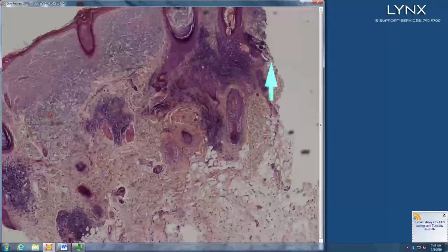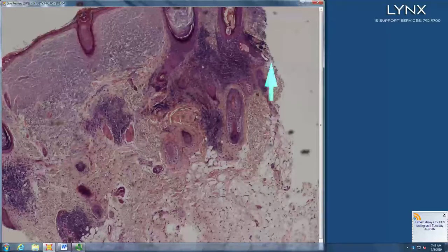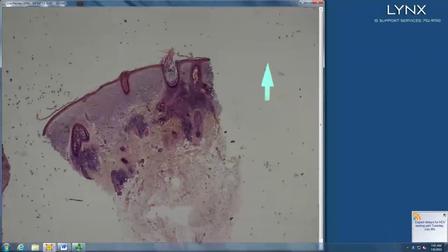So there's very sun-damaged skin with a lot of solar elastosis. There is a patchy follicular infiltrate. Where around the follicle? Is it the infundibulum, the bulb, or the isthmus in the middle? In the middle. Isthmus. Tell me about the follicles.